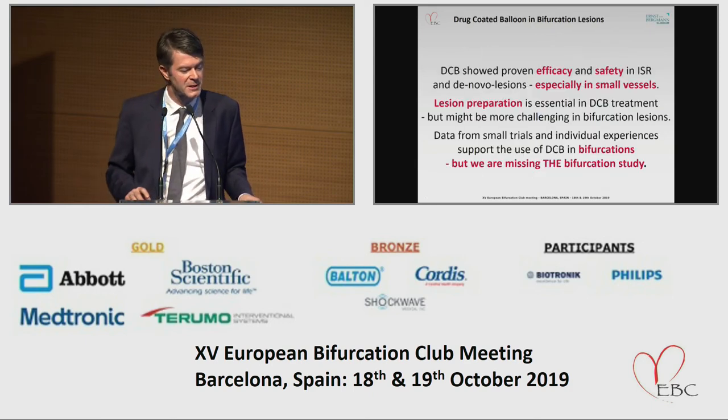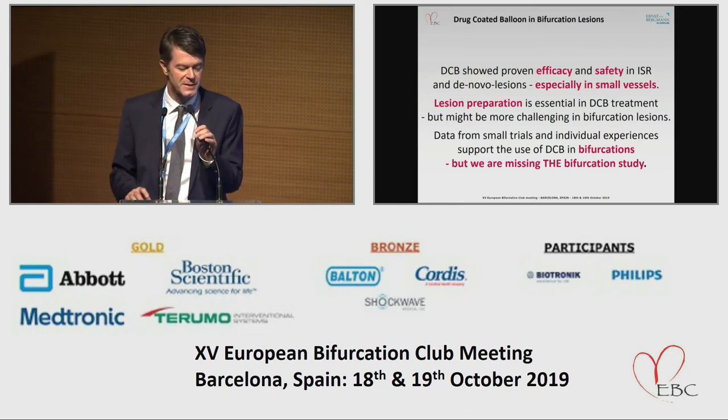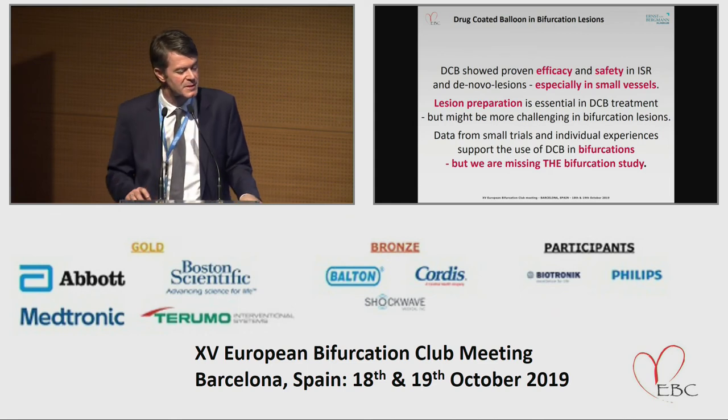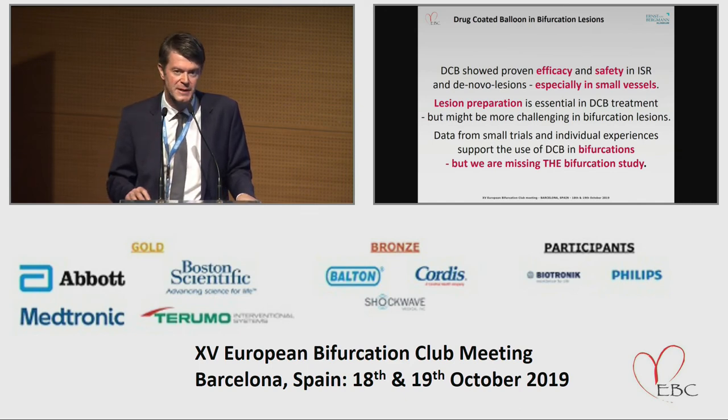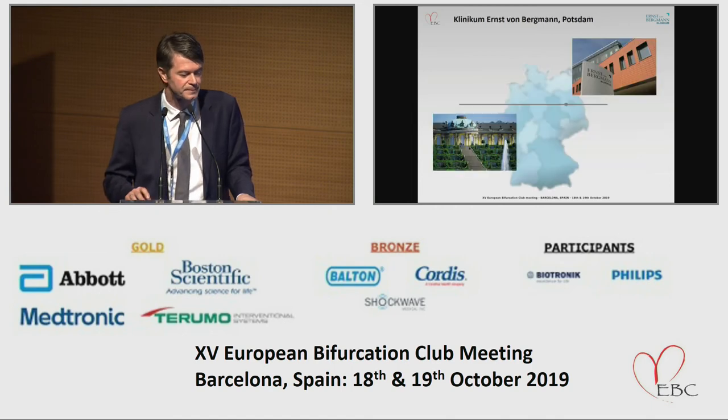So my last slide: DCB showed proven efficacy and safety in in-stent restenosis and de novo lesions, especially small vessel disease. Lesion preparation is essential for DCB treatment and might be more challenging, as we discussed before, in bifurcation lesions. Data from small trials and individual experiences support the use of the DCB in bifurcations, but we are missing the one and only big bifurcation study. Thanks for your attention.